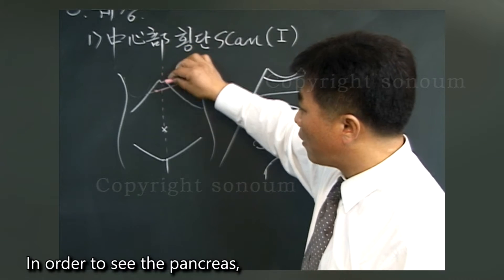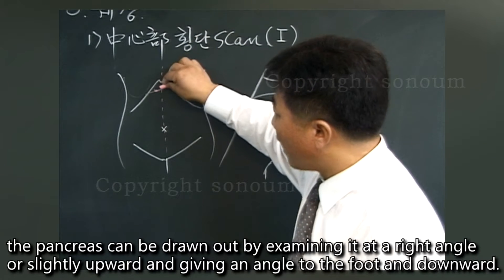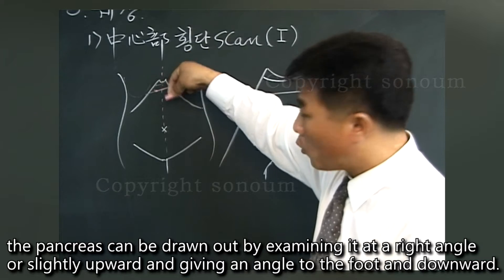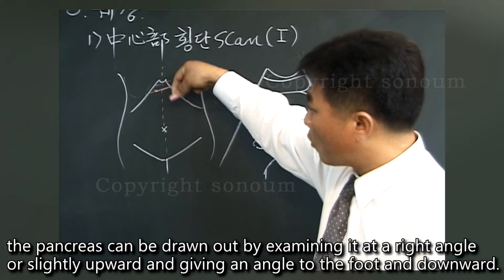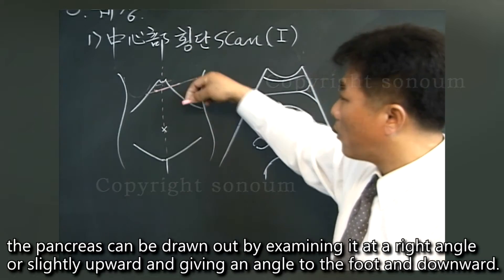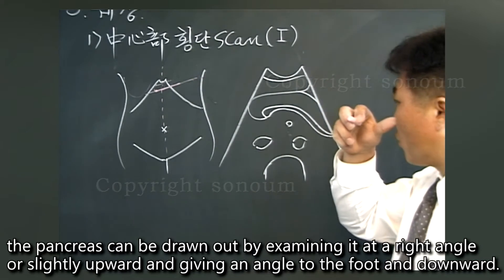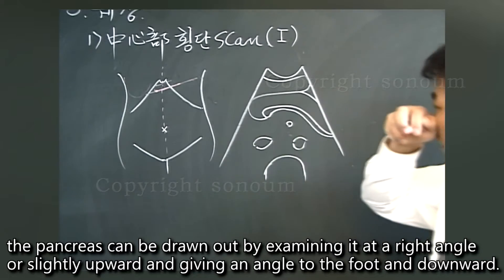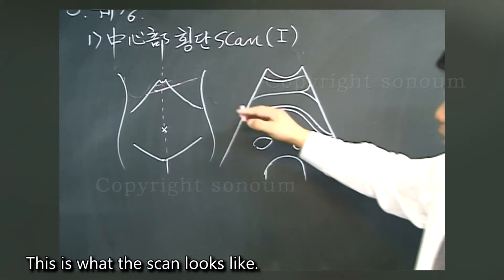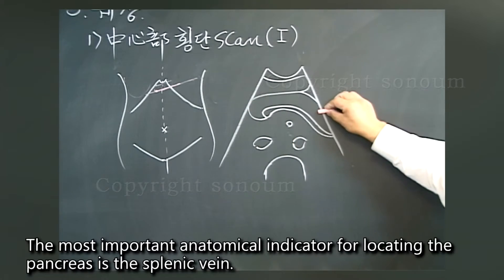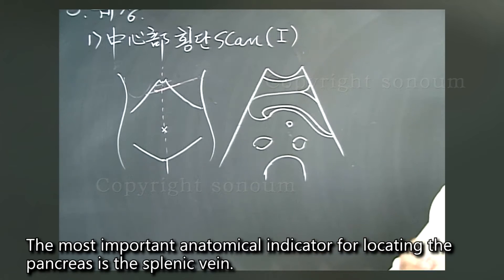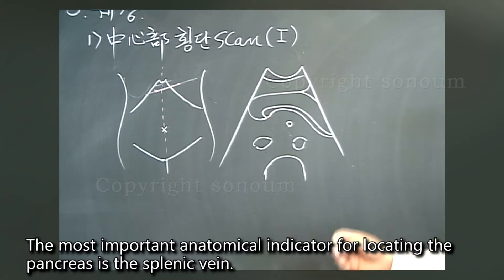In order to see the pancreas, it can be drawn out by examining it at a right angle, or slightly upward, and giving an angle to the foot, downward. This is what the scan looks like. The most important anatomical indicator for locating the pancreas is the splenic vein.